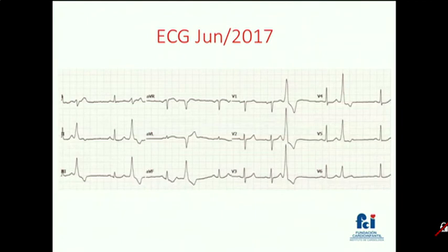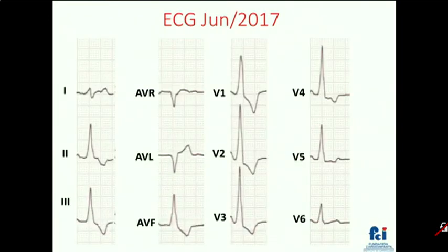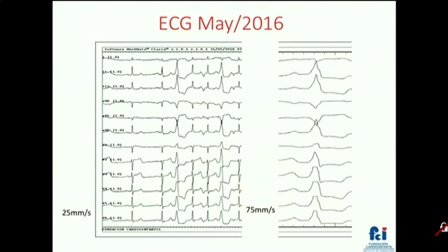This is the latest EKG, where we can see a ventricular extrasystole, which Dr. Garcia was describing. It has a right bundle branch block morphology suggesting a basal origin with an inferior axis, and this suggests then a very basal issue at the lateral level of the left ventricle.